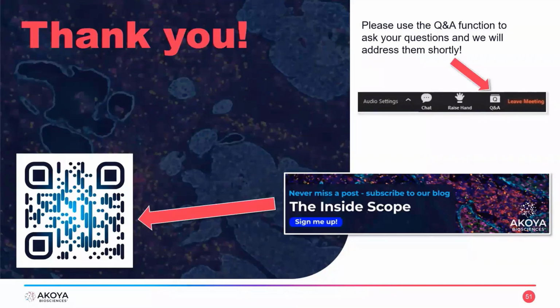Will running the simulated H&E before multiplex interfere with antibody specificity or co-localization? No, running the simulated H&E won't interfere with any antibody specificity downstream. You should still be able to see 3 to 4 markers co-localized on a given cell. Opals only bind within around 10 nanometers of the target epitope, so we don't have too many markers that have membrane colocalization issues. So the short answer is no. Running SH&E shouldn't interfere with anything downstream.